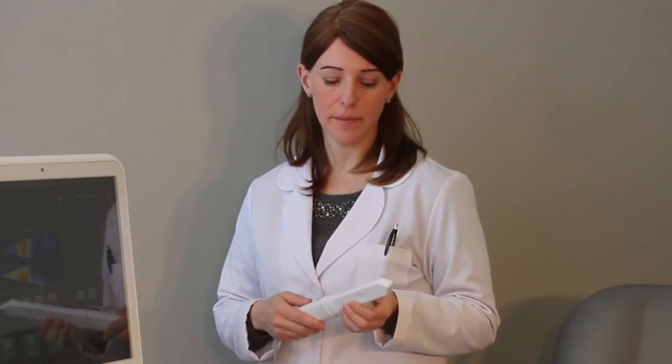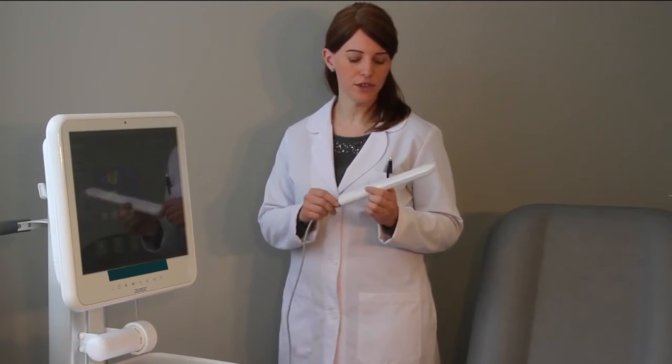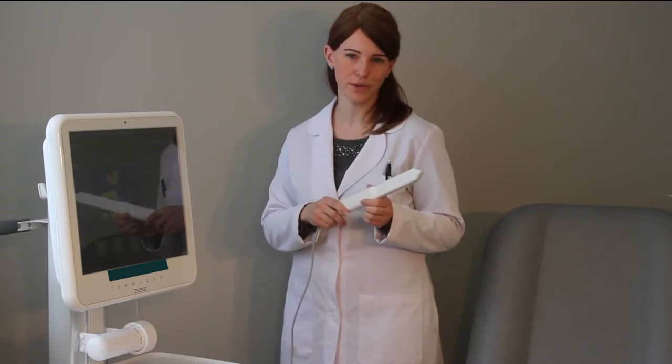We designed a new vaginal tactile imaging probe to image the entire vagina, the underlying support structures, and the pelvic floor muscle contractions in real time. The probe sensor has 96 sensor arrays along either side, and it measures approximately 11 centimeters in length. It also includes a motion tracking sensor, a temperature controller, and 2 microchips that communicate with the main computer.